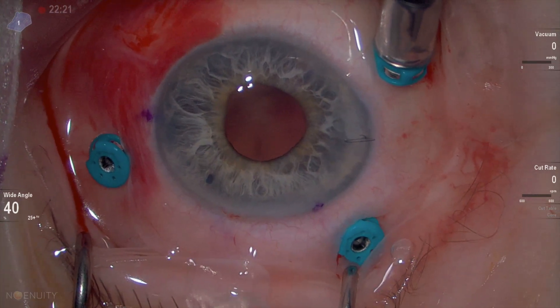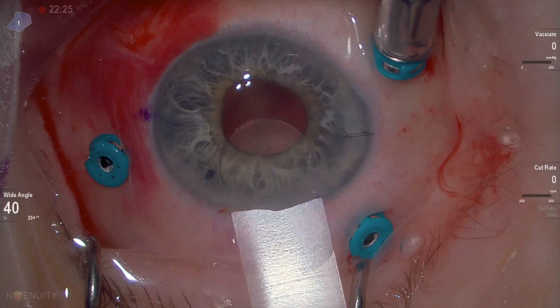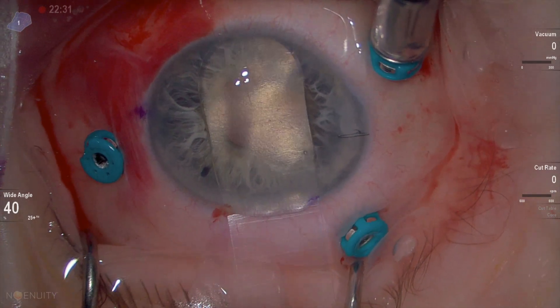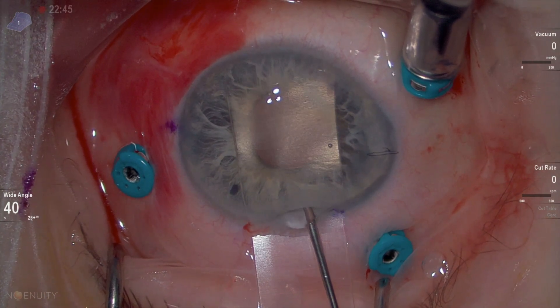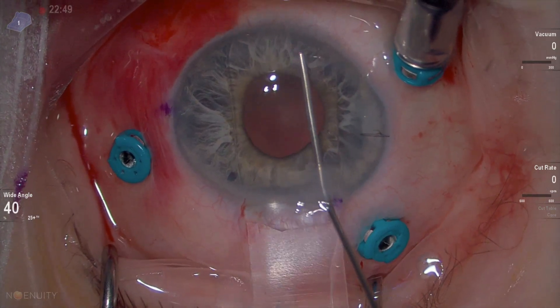We like to use a sheet glide to place the lens over. This is a sheet glide introduced in the anterior chamber, aiming to the angle of the eye — try not to pick any iris tissue. The viscoelastic is placed over the sheet glide to open the anterior chamber.